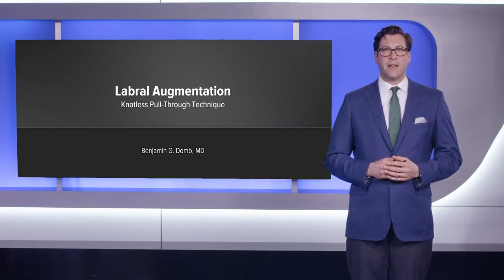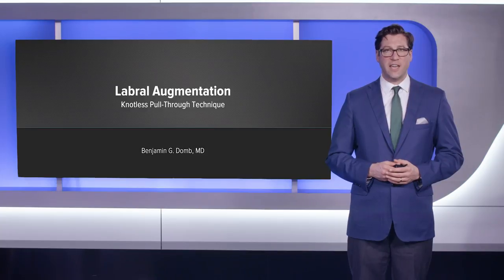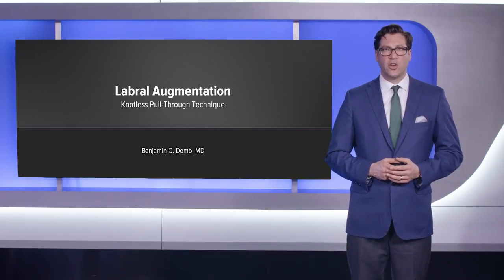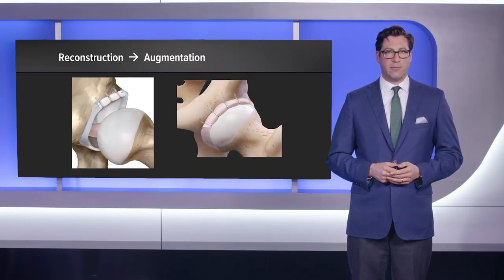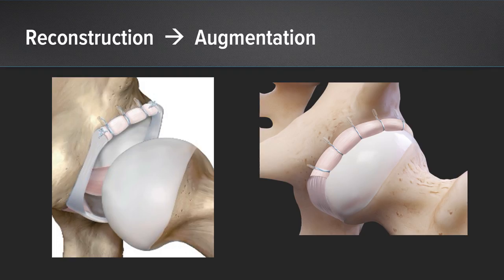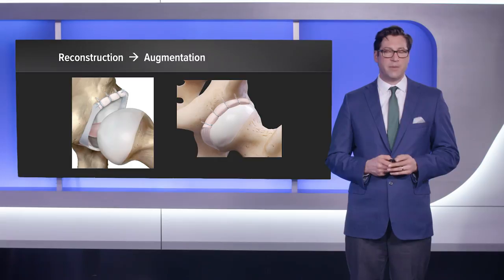Hello, Benjamin Dohm from the American Hip Institute presenting today on labral augmentation in the hip using the knotless pull-through technique. Notably, the knotless pull-through technique is one we have used extensively for labral reconstruction. This technique has been adapted for labral augmentation using the exact same set of steps as for labral reconstruction, however the difference is that whatever is left of the native labrum is preserved.